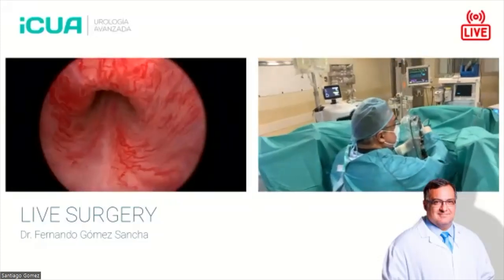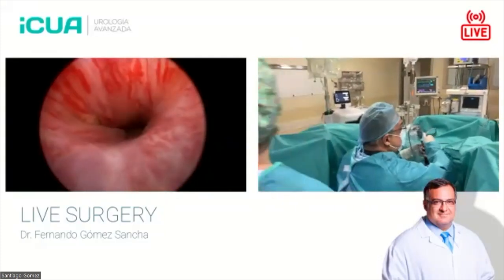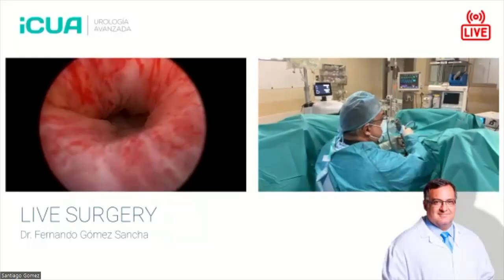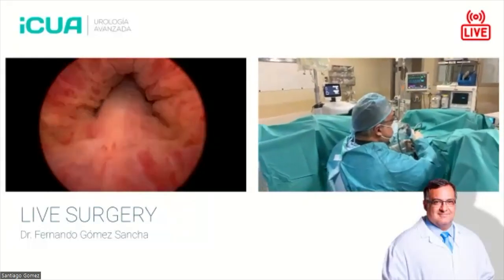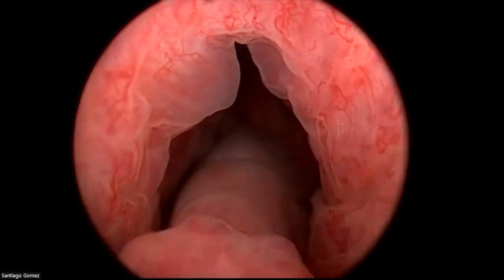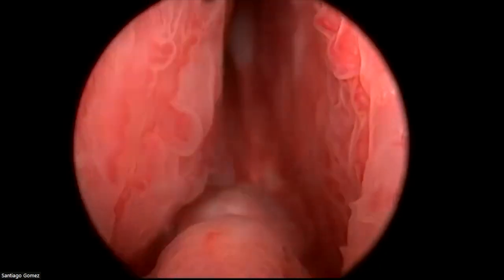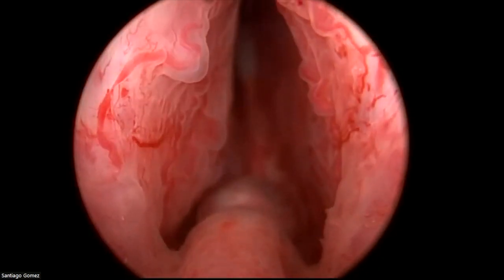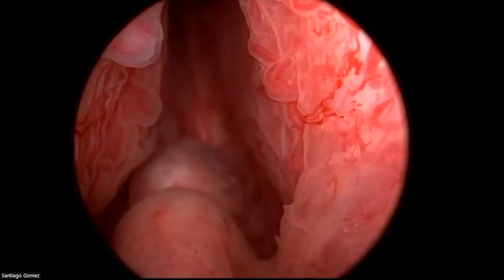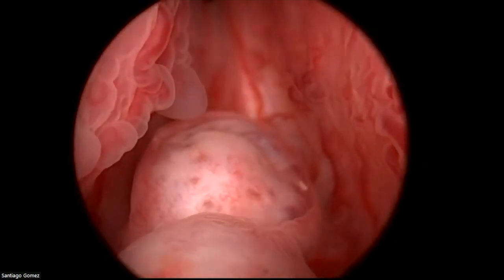Okay. So here we are approaching the apex. Typically, it's a little bit tight here in the membranous urethra, but here we are again. I like to enter slowly because I can see the shape of the sphincter right from the beginning, you see. Here we can see the limit between apex and adenoma. And just as in the last case, you see the verumontanum is further inside.